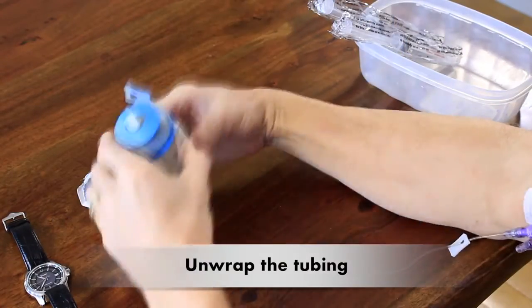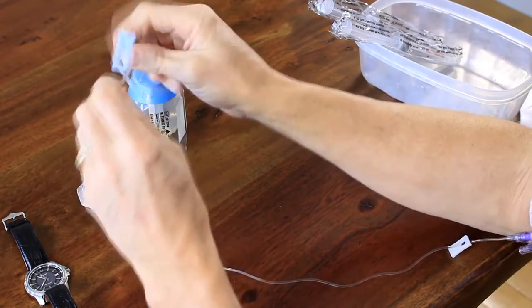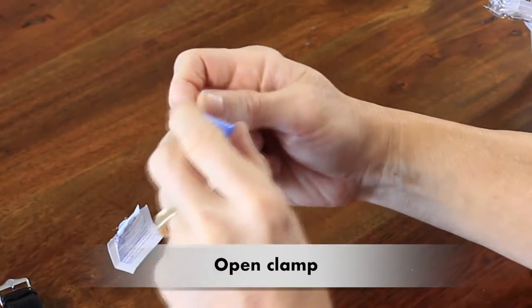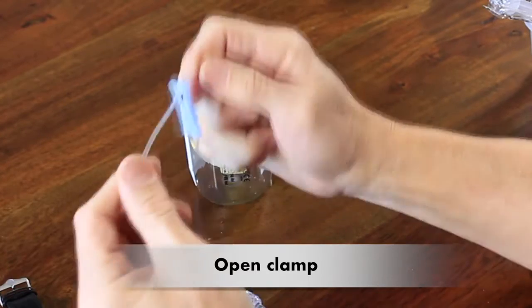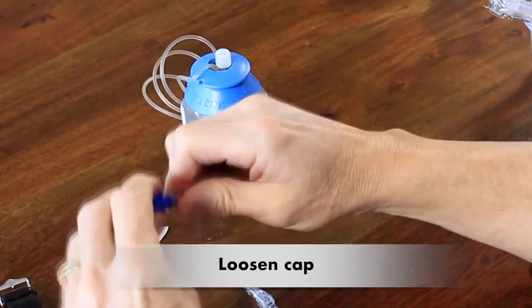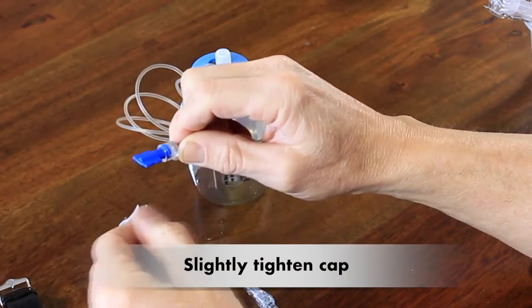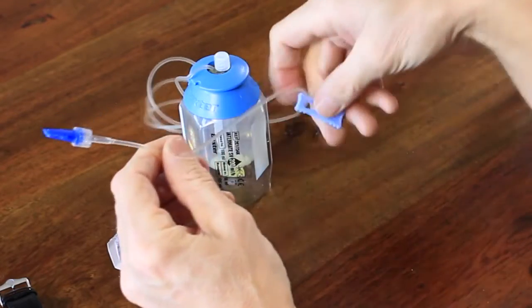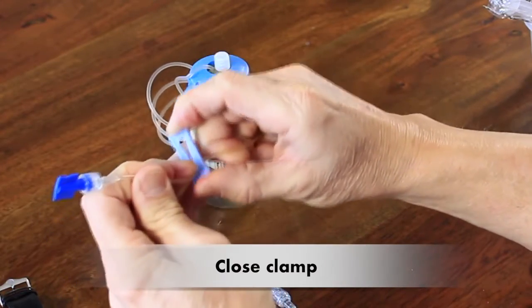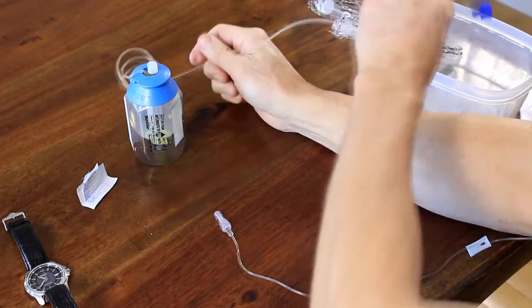Unroll the tubing on the top of the pump. The clamp is pinching the tubing closed so the fluid can't flow. So you need to open that clamp. Just slide the clamp forward to open it. Now loosen the cap by turning it just a little bit. You don't want to take it off. And the fluid will start to drip. When it drips, turn the cap, just slightly tighten the cap. Don't make it too tight. Close that clamp by pushing the clamp forward so that it pinches the tubing. You can set the tubing aside in your container.